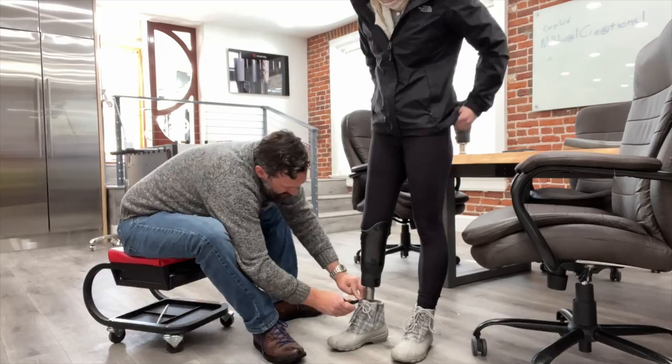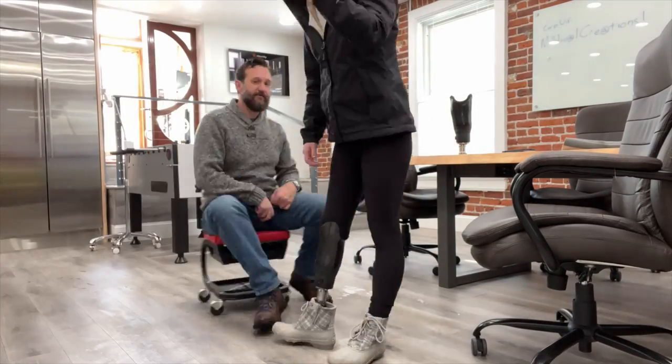And so today I'm gonna embark on a brand new adventure. I'm headed up to Denver to work with the folks at Extremity Prosthetics to make an entirely different system of attachment for me. I'm going to be trying something called the pin lock system.